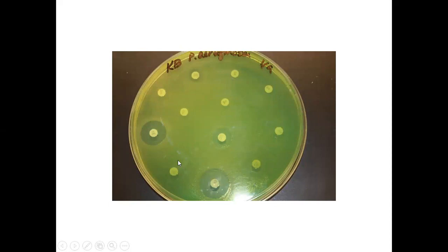Here you can see the test of antibiotic susceptibility, and you can see that only two antibiotics show intermediate antibiotic sensitivity. So for this bacteria, all these other antibiotics do not work.